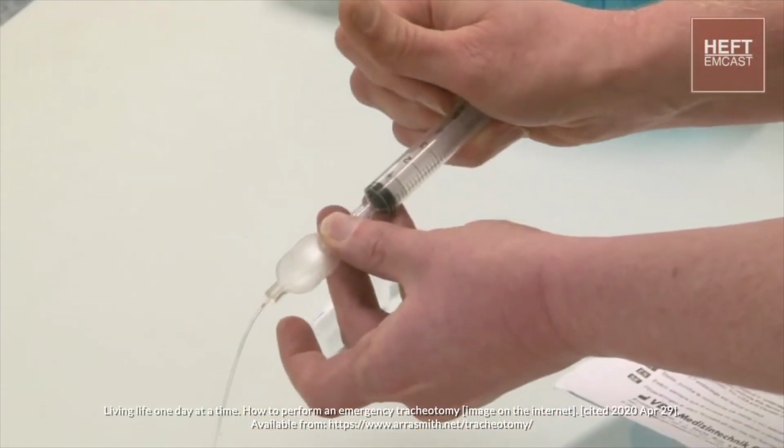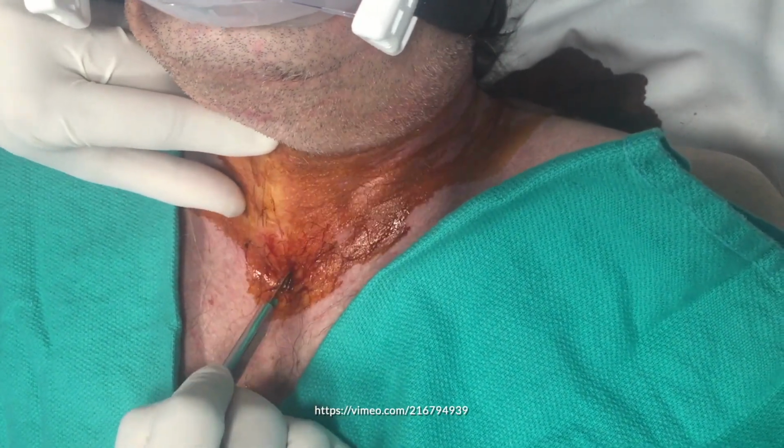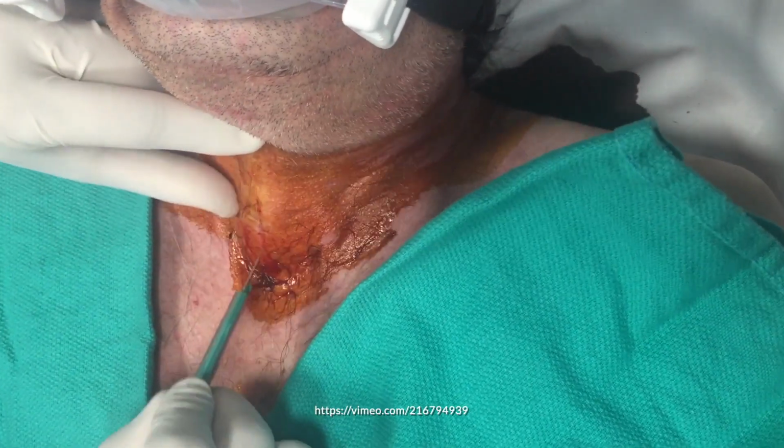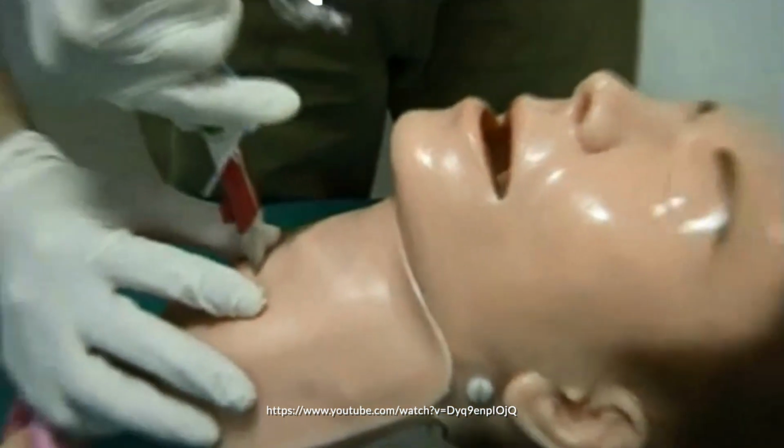Lay the equipment on a clean cloth and test that the cuff is functional by inflating and deflating it with air. Attach a second syringe filled with saline to the back of the Quick-Trach 2. Swab the area and stabilize the cricothyroid membrane by applying traction to surrounding tissue using your index finger and thumb. Next, use a scalpel to make a vertical incision about 2 to 3 millimeters deep, but do not cut through the membrane. Then, while holding the Quick-Trach 2 on a 90-degree angle to the neck, puncture the cricothyroid membrane.